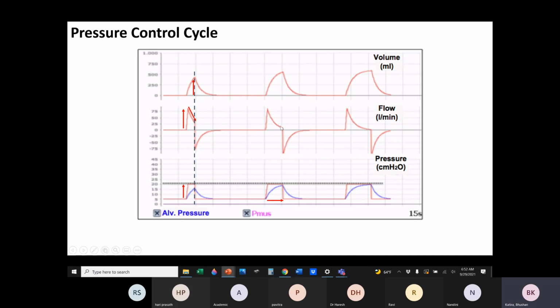This is still a part of inspiratory flow. The peak flow reduces, but the flow is still inwards because the alveoli are still filling up, since the system is pressurized. That means the gas is still moving forward until the point where the alveoli cannot take the gas anymore or have achieved the same pressure as the airway pressure, as in this case.